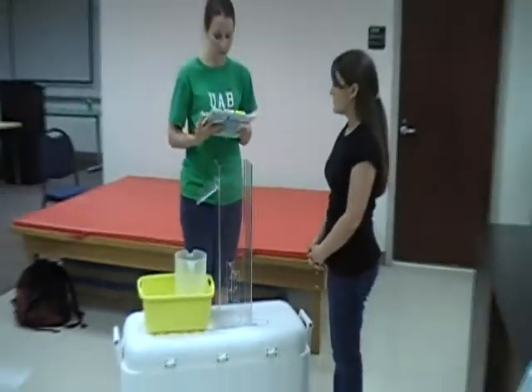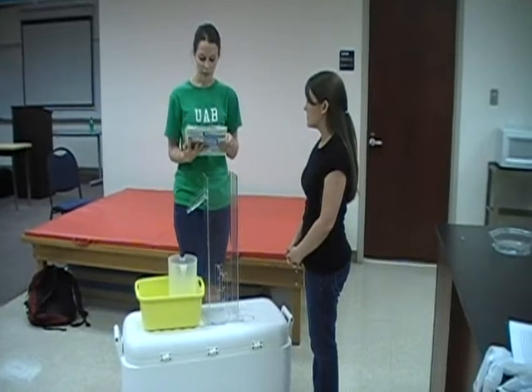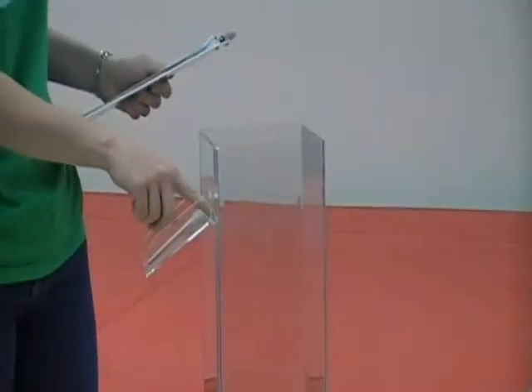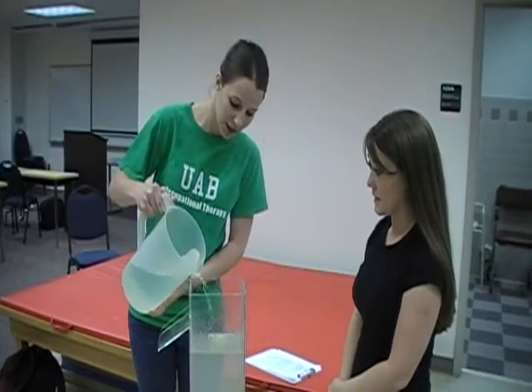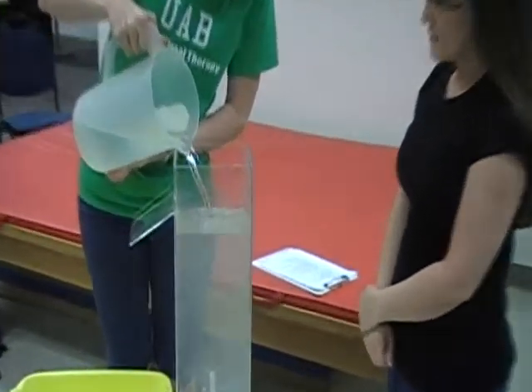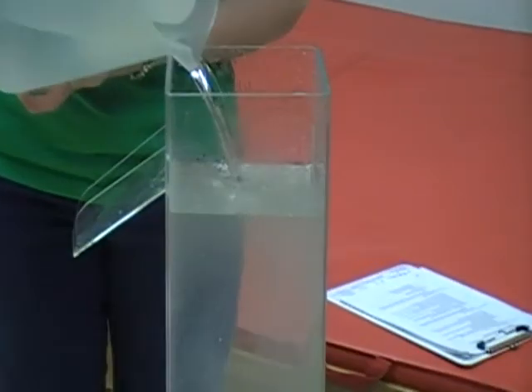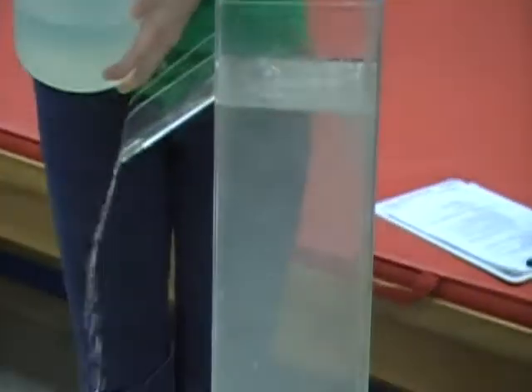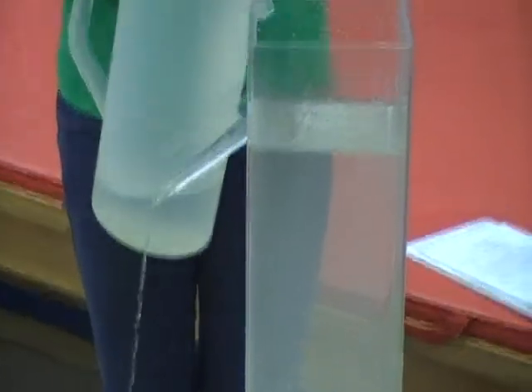Next, you want to fill the volumeter with room temperature water to the point of overflow. The point of overflow is just at this line here. We're going to finish filling the volumeter to the point of overflow and just let the excess water pour out.